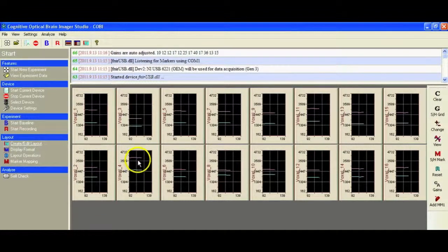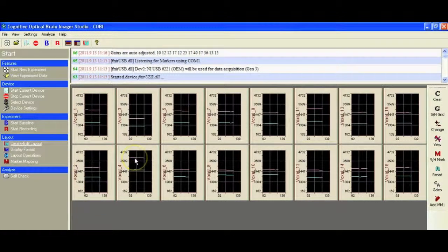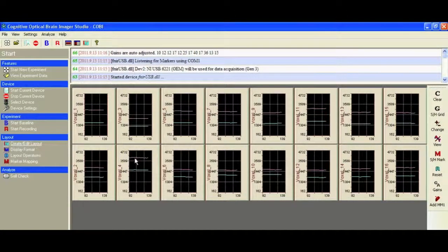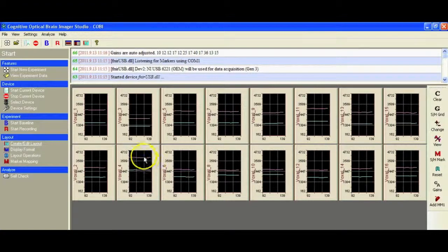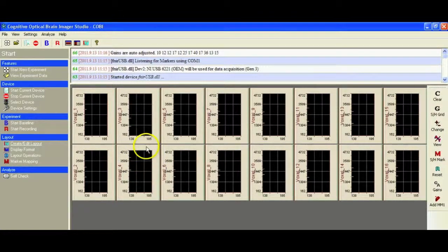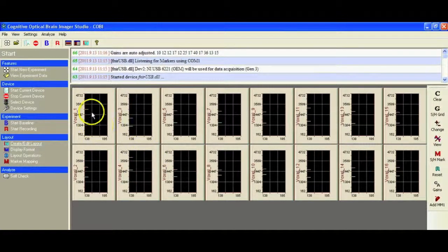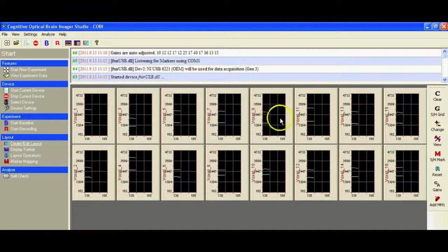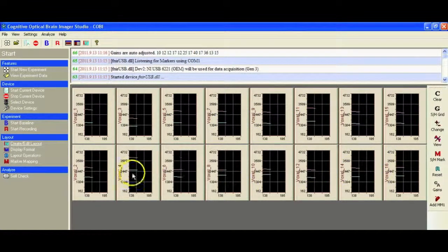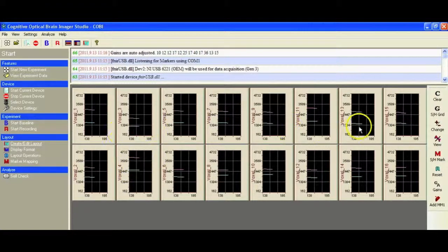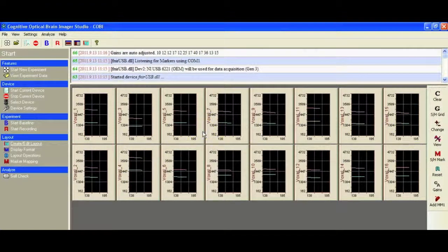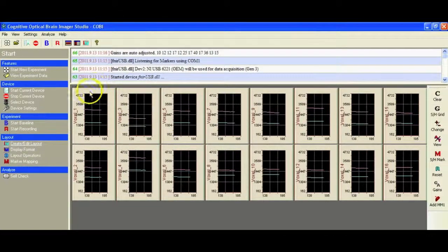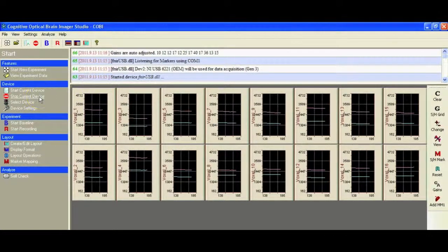It looks like all of them are good with the exception of this channel over here. I'm not going to worry too much about that for the purposes of this tutorial, but you'll find that you can play around with that. Maybe if we adjust the sensor just a little bit, we can get this one in play. But really the idea is to try and get each of them in that 700 to 3000 band. With the exception of this one, I think we're good to go. So at this point we can stop our device.